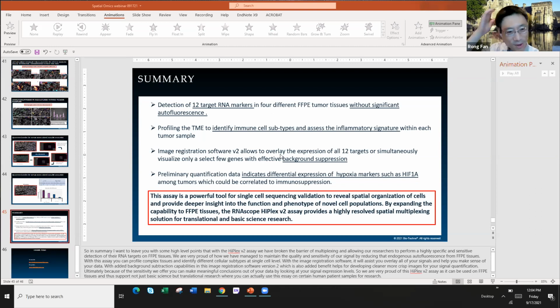Maybe a very cool experiment to do is 12-plex, where every three probes or three genes you look at in the first round, the second round you look at the same ones, and the third round you look at the same thing. Then you can quantify the technical variability, and you know how much variability you see across different cells is above that level, and that's real. That actually tells you interesting biology. Correct, if you see them at the same expression level over and over again in the different rounds.